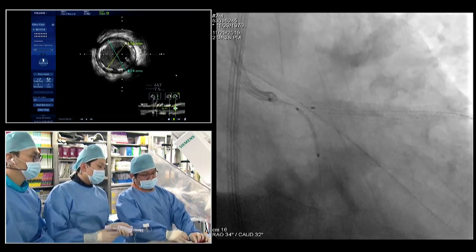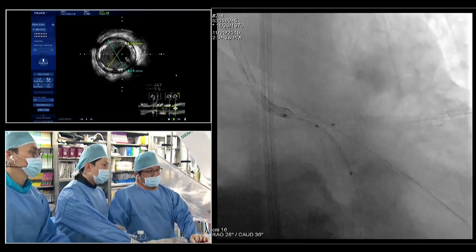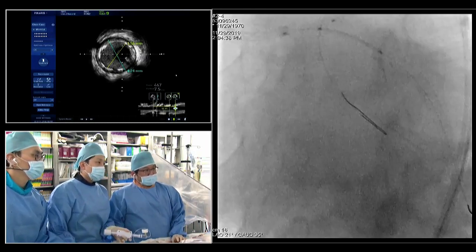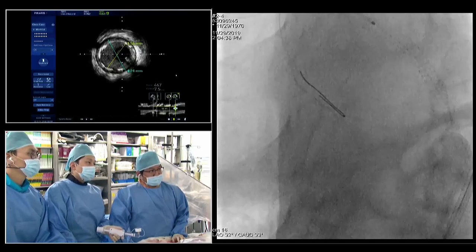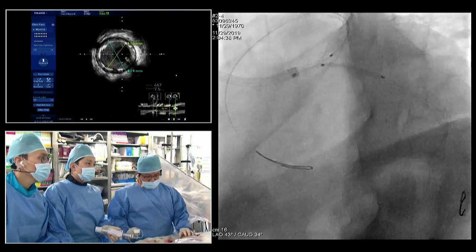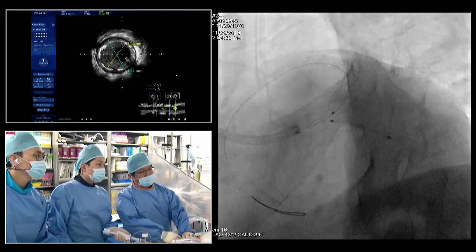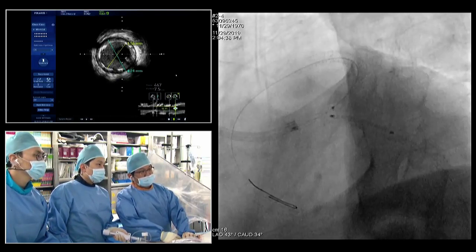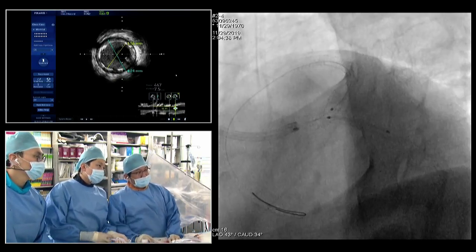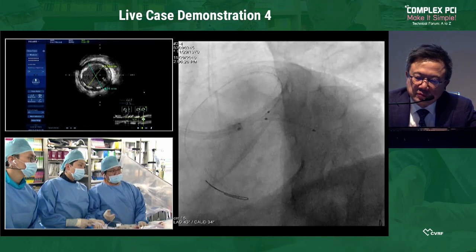So how about T-stenting? TAP? Do you prefer more of a crush? I think TAP is very convenient, a very good option, very quick. But if something happens later, the treatment would not be easy. So the more perfect treatment for such a complex ostium would be a crush rather than the TAP technique. So you just don't want to have any metal sticking out into the left main or proximal LAD, right?